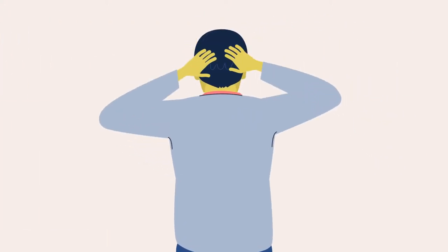You need to sit or stand in a position where you can easily reach the back of your head with both hands.